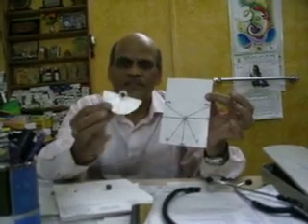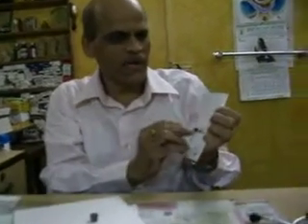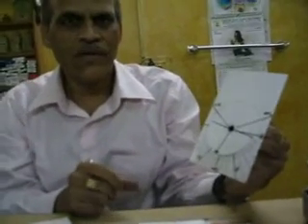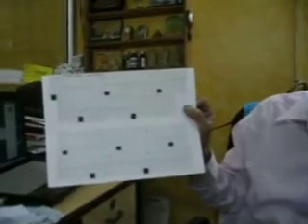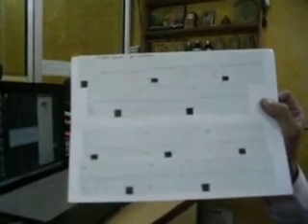And this is a small semicircle with a line drawn in between, and what I am doing here is that this has been fitted onto this. The principle on which this works is that in a given ECG, for example, this is the ECG over here, you should only see what leads are showing the positive deflection. If leads 1, 2 and 3 are showing positive deflections, in addition AVL and AVF are showing positive deflections.